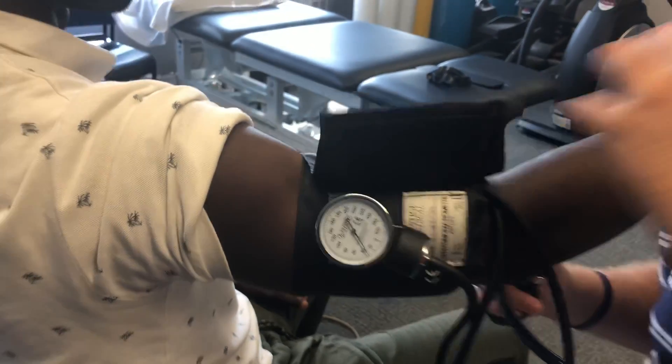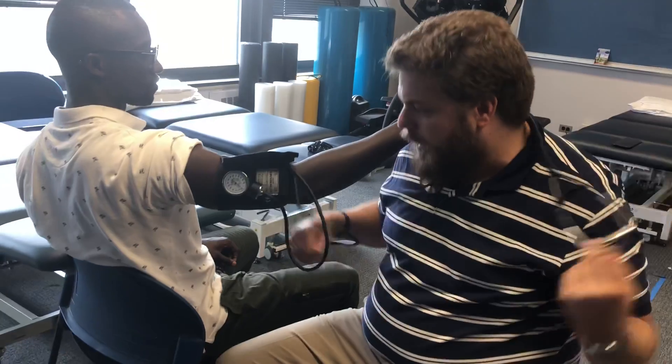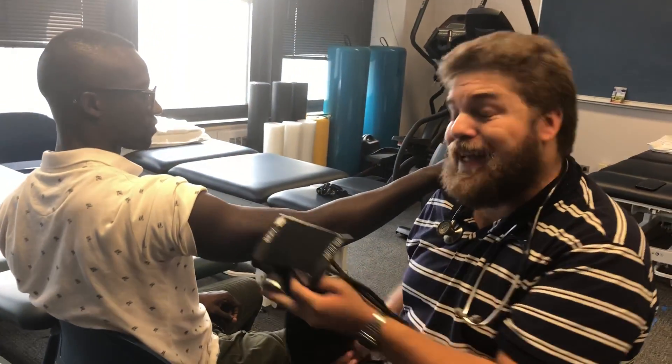I got 108 over 74 — that's perfectly normal. Normal ranges for blood pressure are less than 120 systolic and less than 80 diastolic. The new guidelines state anyone above 129 is now diagnosed with hypertension. Realistically, the evidence suggests that even if your values are above 125, that's still predictive of future untoward events. So it's really important that we take blood pressure measurement very seriously because blood flow predicts the health and function of all your organs, and if it's running at a higher pressure than it should, that can lead to complications.